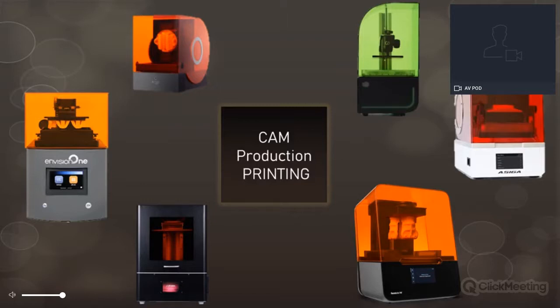And of course, there are some processing issues with completing the work. Not really issues, but additional steps involved with completing the surgical guide. But it gives us the ability to do everything in-house and to do everything in full control of each stage to give us the predictable outcome.